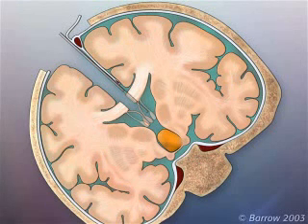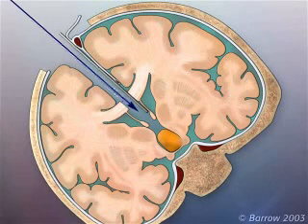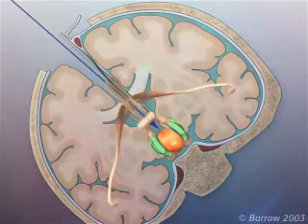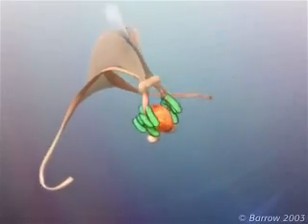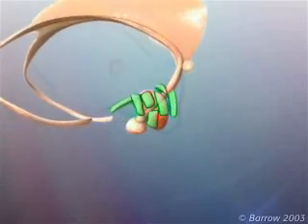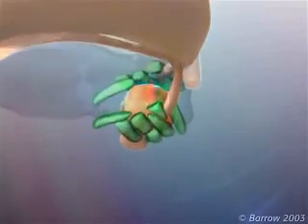Gentle retraction on the septum pellucidum separates the columns of the fornix, allowing the surgeon to safely enter the third ventricle. The fornices are nerve fiber tracts that terminate in the mammillary bodies. This approach is designed to avoid injury to the fornices, which can cause loss of short-term memory.